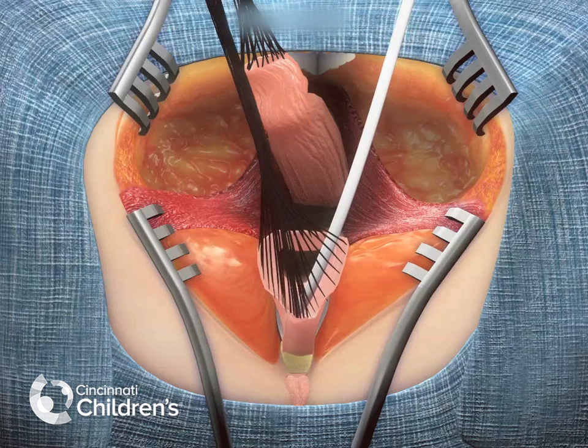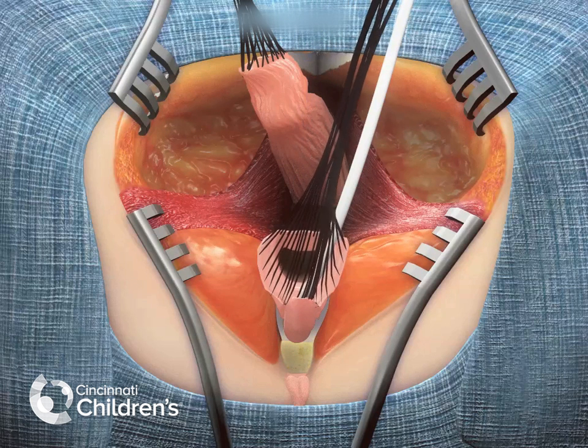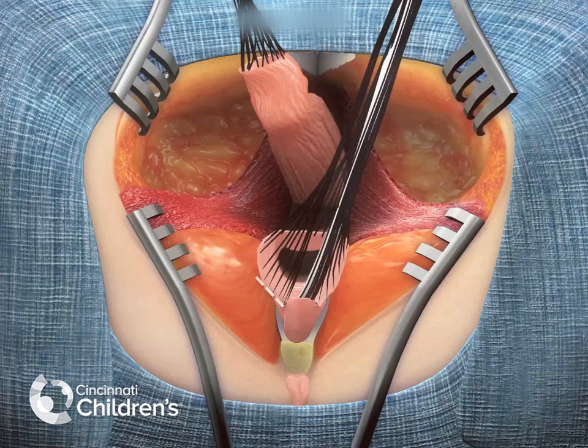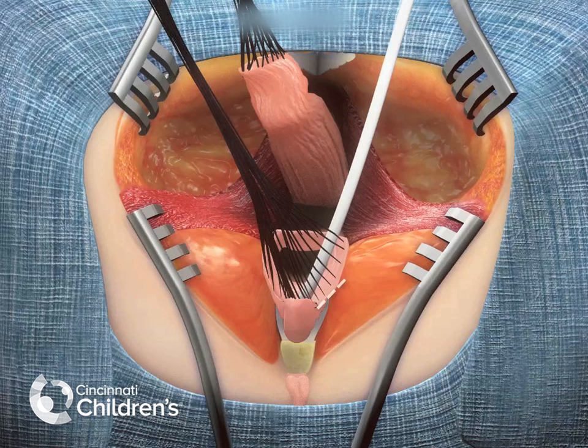As seen here, with sequential dissection, this structure can be completely freed from the pubis and from its lateral attachments.